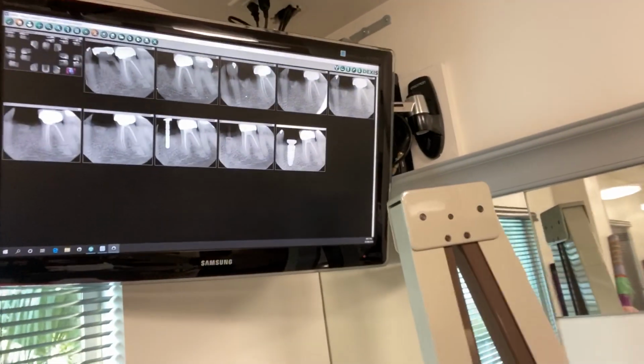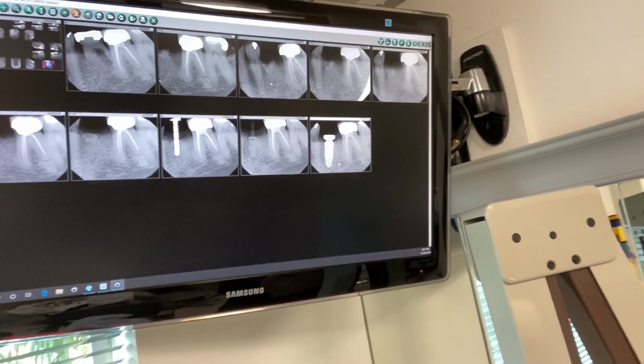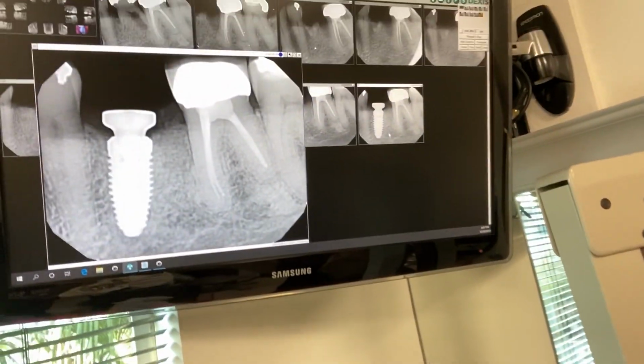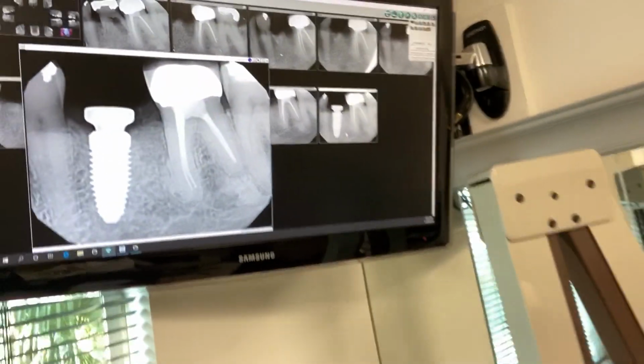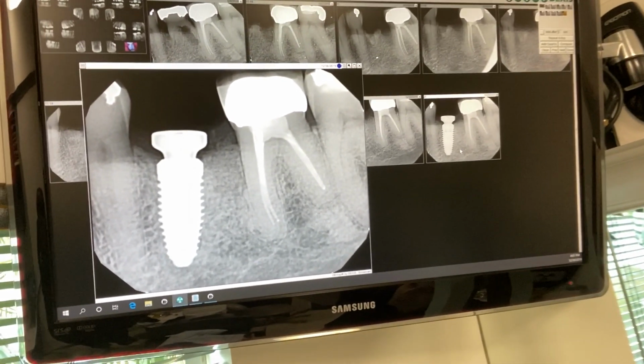Patty and Ashley just assisted me in placing this molar implant. You see, the original tooth was a primary tooth, and it's going to be restoratively about a premolar and a half. So I felt comfortable, and I had the bone for it, to place a wide diameter by 11.5 implant that will have great contact areas and great embrasure spaces.